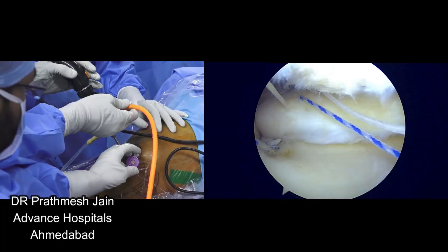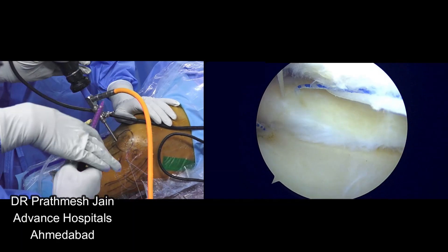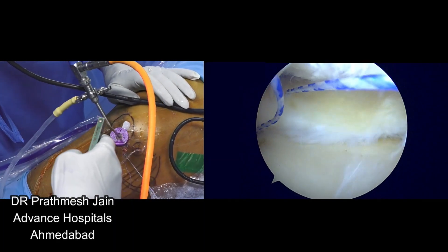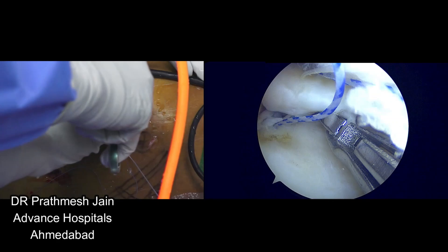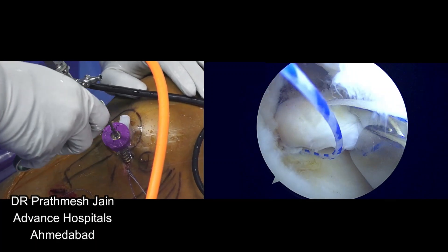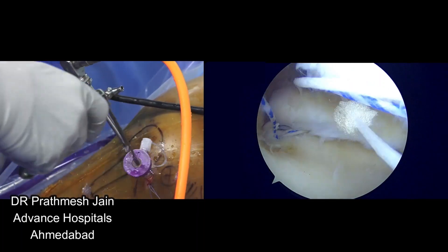We are good. Now what we want to do is tie everything. This will be a Mason Allen repair because we have two suture limbs of the white which are in mattress fashion and one suture limb of the blue which is in simple fashion. If you want to increase the healing potential here, you might use a curette at the insertion — that will increase the healing potential, though it is not mandatory because we have already drilled a tunnel. At this time you can check the reduction; since we have done a good posterior release, we are able to achieve good reduction medially, laterally, and anterior-posteriorly — technically we are all set for the repair to proceed.